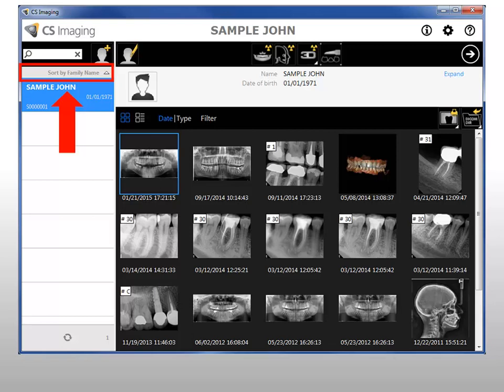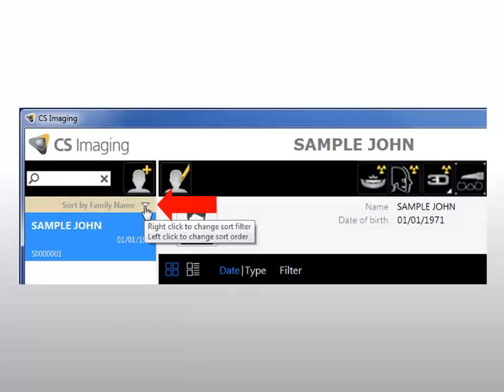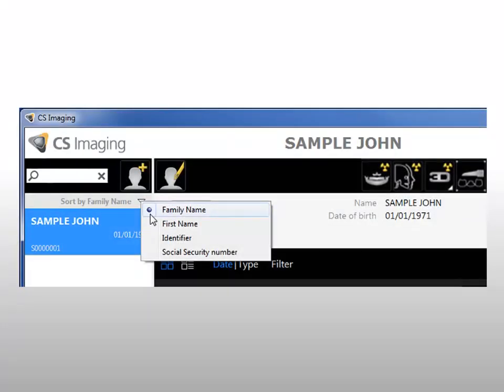Sort the patient list and patient history. At the top of the patient list, the current sort filter is displayed. To change how the patient list is sorted, click the small triangle to change sort order from ascending to descending. To select a different filter, right-click on the current sort filter.